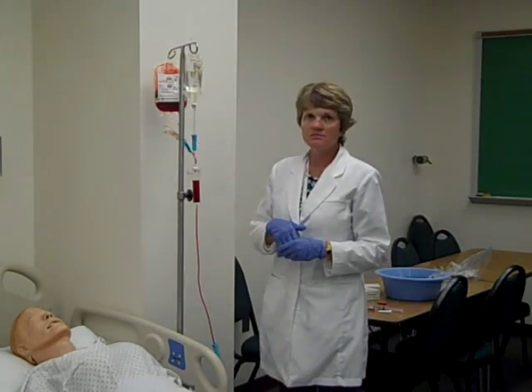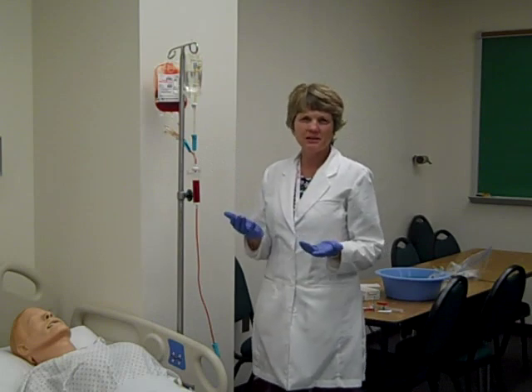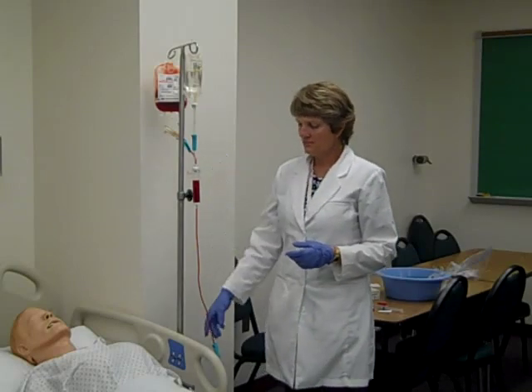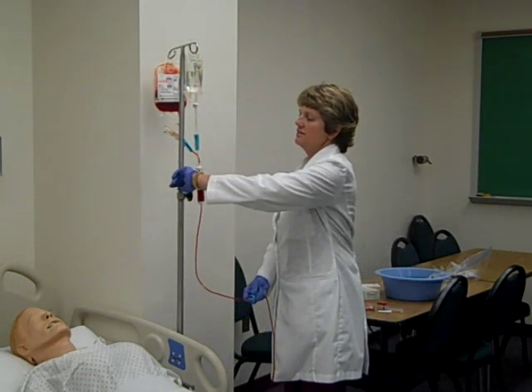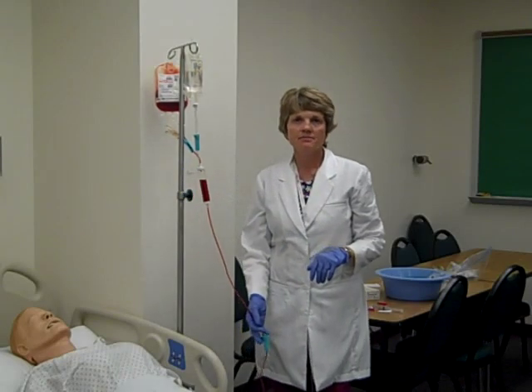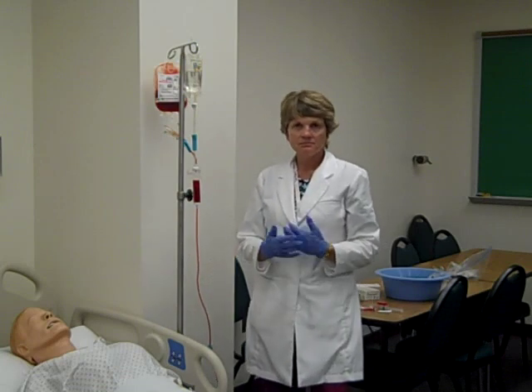At this point, because it's best if we can get the blood in at a rate that's as fast as the patient can tolerate, I'm going to try to get this unit of blood infused over a couple of hours. So now that I see that there was no reaction and that vital signs are fine and lung sounds are fine, I'm going to bump the rate up to 125 milliliters an hour. Okay, so I'm going to go ahead and do that. And it should go in well within our whole 4 hours time limit. And I'm just going to monitor the patient as per hospital policy.